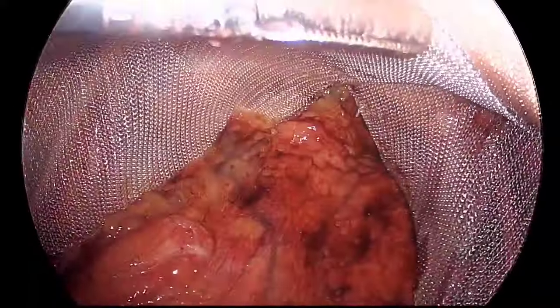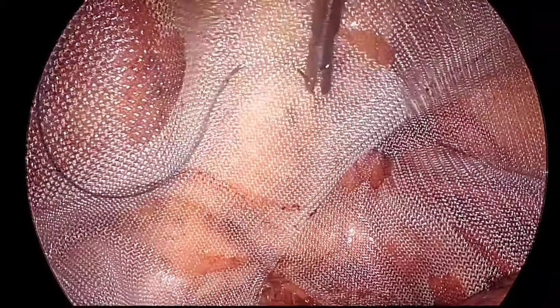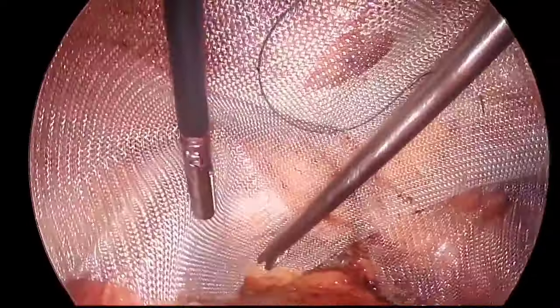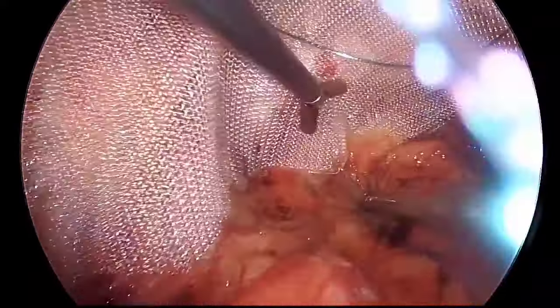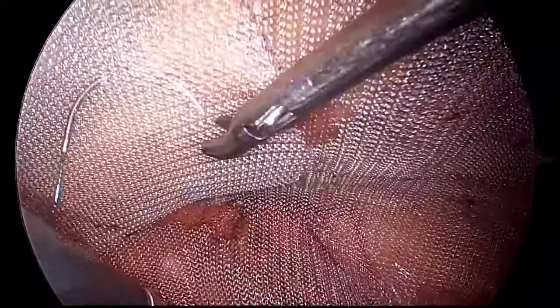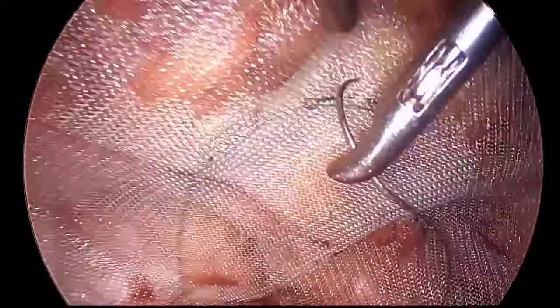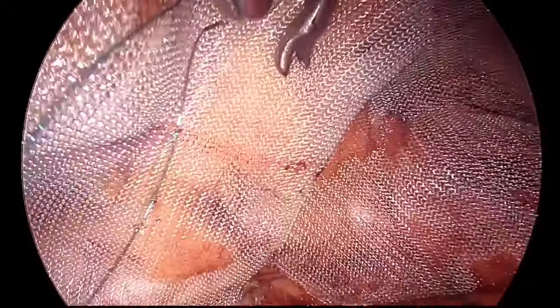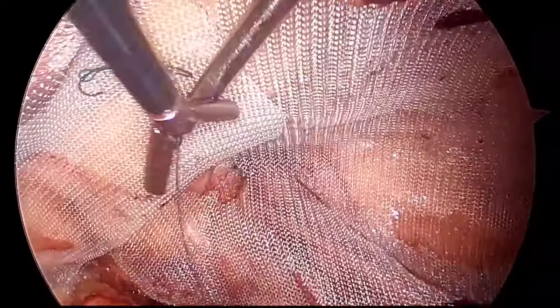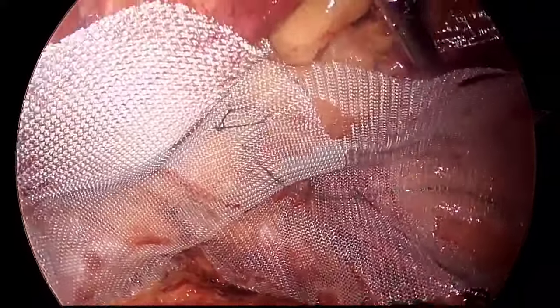Now what I will do is, because that was a recurrent case, I will be fixing the mesh. This is a 3-0 V-Loc suture, absorbable V-Loc suture. What I am doing at the midline and the lower abdomen midline, I am taking one bite to include both the meshes and fixing it with the rectus abdominis. As these barbed sutures, I am taking two bites and keeping like that, so that will keep the mesh in that position till it gets fixed. So that is one fixation.